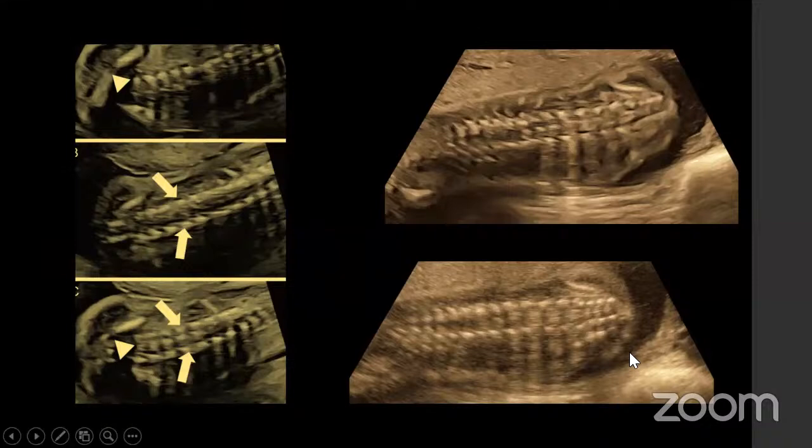Now going further, the coronal spine views are usually done to evaluate for diastematomyelia, hemivertebra, and also scoliotic deformities of the spine. So you can also appreciate the spine at the level of the body, posterior recesses, at the level of the lateral masses, in the three aspects. You can appreciate the tapering of the spine here, the sacral tapering. You are appreciating the iliac blades. Again, this is with CRI and SRI on. You're not appreciating the vertebral bodies, but here, yes, you're appreciating the vertebral bodies better. There is no abnormality. There is no scoliotic deformity. You can appreciate the spine in all the three, the vertebral bodies, lateral arches, and at both levels.